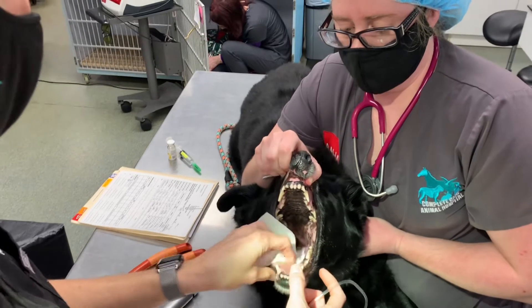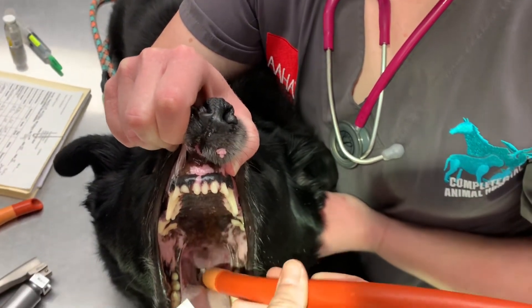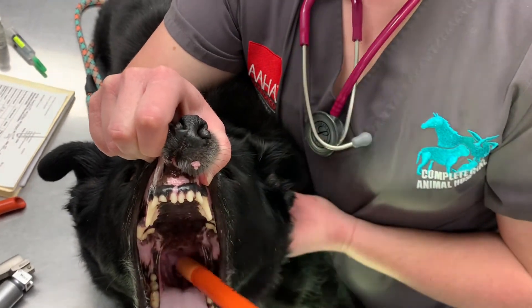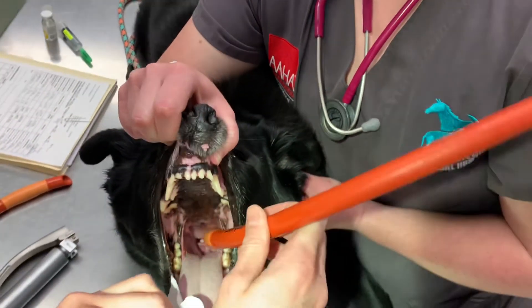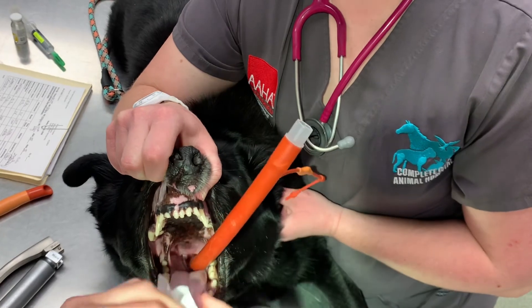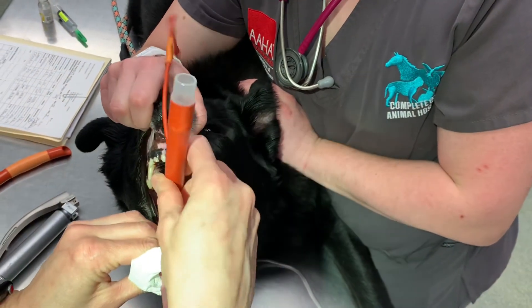Pulling the tongue back, you can utilize your endotracheal tube. You can see right down through the larynx and basically pass your tube. To the left you can see the esophagus. You can feel the tracheal rings to confirm placement. You can bag the patient and feel at the end of the tube — it's pretty straightforward passing your endotracheal tube right in.